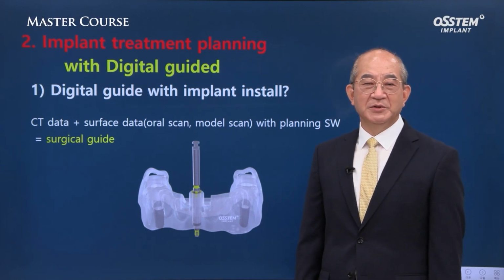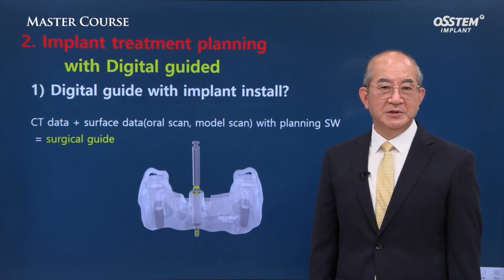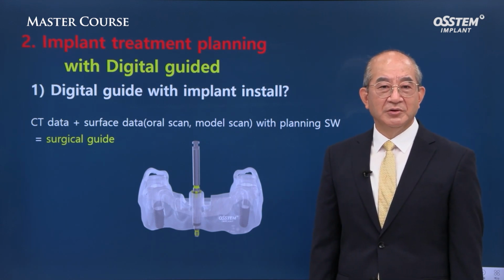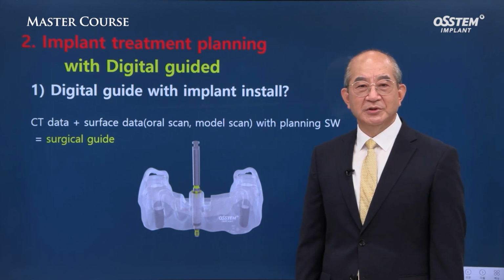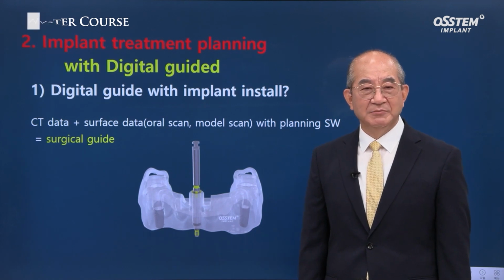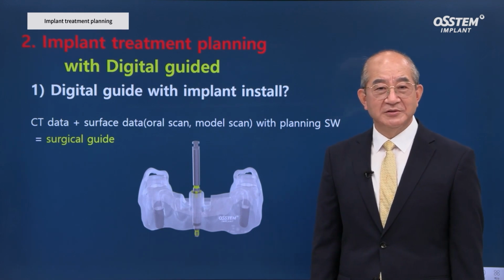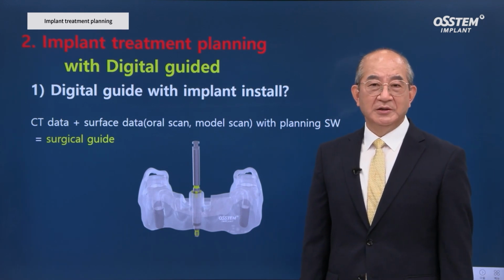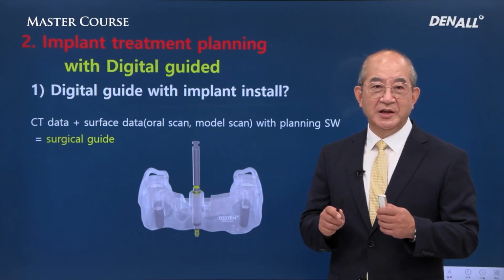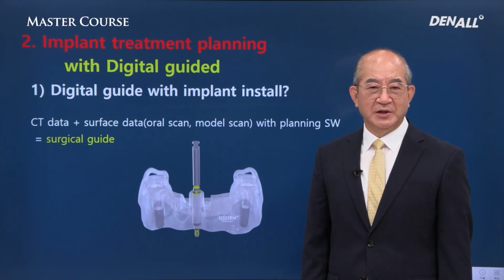In order to have these equipments, basically you need to have film. You also needed to have developer and fixatives for the film. You needed to have these components in place to take X-ray images for implant treatment. These components are what your staff would worry about when they came into the dental clinic Monday morning. They would have to frequently replace the fixatives or developers.